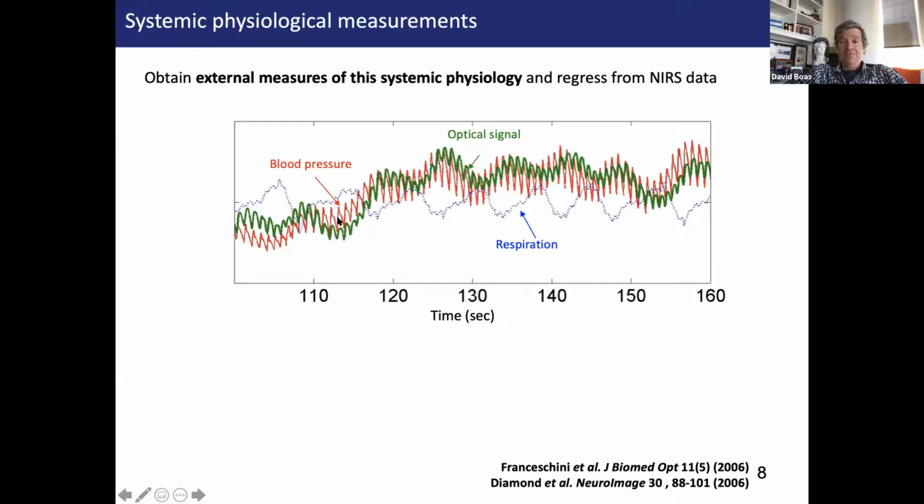the blood pressure. And the blood pressure in particular, you could see in the red line measured from the fingertip, correlated incredibly well with the optical signal we were measuring from the head. So this is when we started to realize, geez, we are very sensitive to blood pressure changes, right? Basically what's happening is as the blood pressure changes, it's just changing arterial blood volume in the scalp. And we're very sensitive to scalp hemoglobin concentration. So this is what we're seeing here.